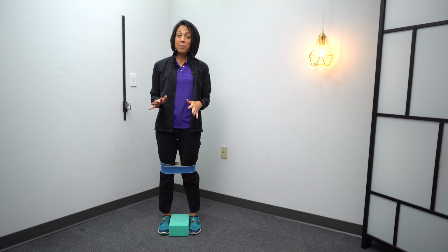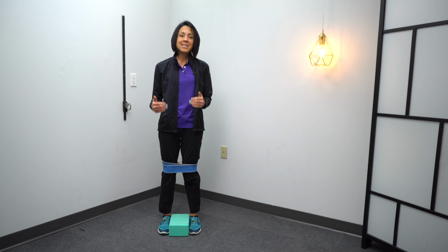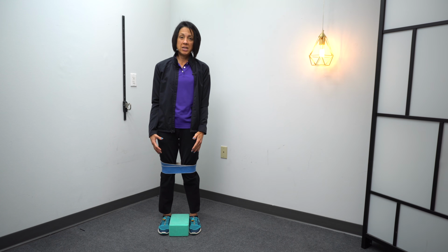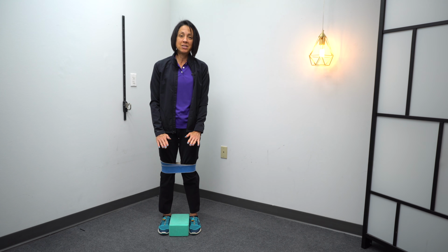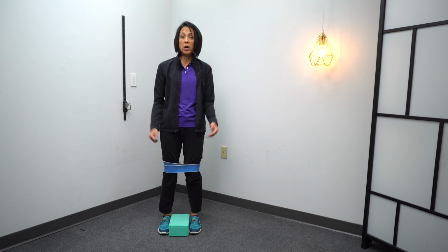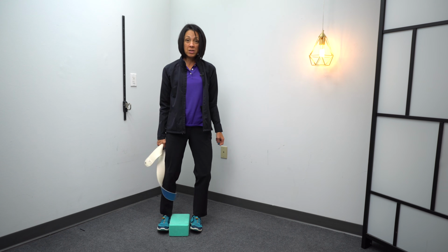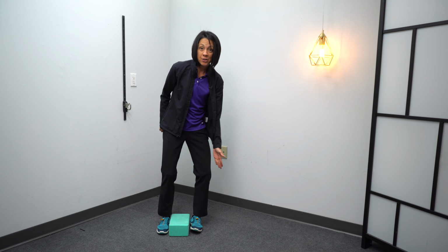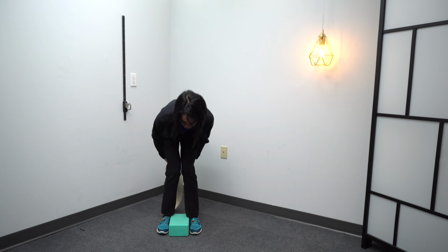Now remember, and it is worth repeating because I did just see someone in this situation, so it's really top of mind right now for me, if you are someone where your knees cave in, do not force your knees into this position. You can have spasticity and your knees can still cave in. Do not force this position. This position is intended for those of you who, when you walk and someone videos you or you walk in front of a mirror, your knee looks like it is bent outward like this. Then this set of tools might be beneficial.